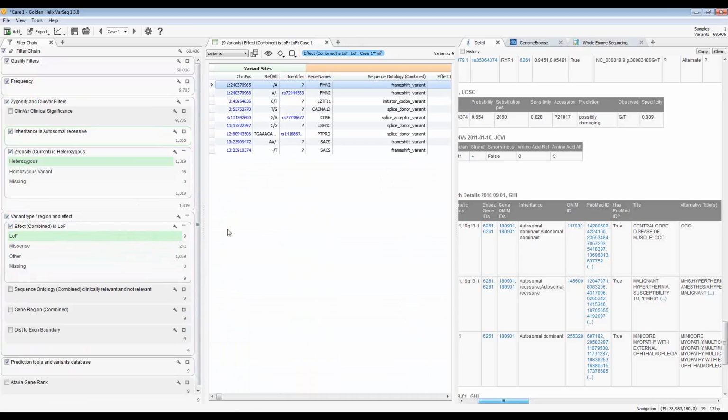What I am looking here, I am not really looking for the heterozygous variants. I am looking actually more for what I would expect to be a compound heterozygous, and VarSeq would be able to do compound heterozygous assessment if you have trio samples. However, from our experience, perhaps Hauwa and Brendan can correct me, if you have only a single case, we do it more of a manual curation.